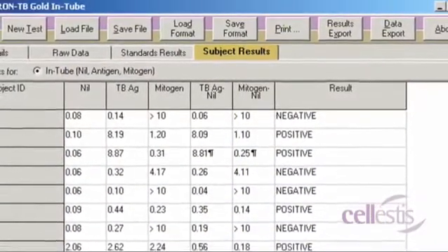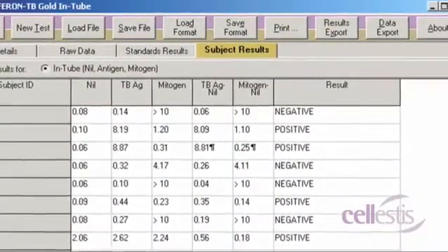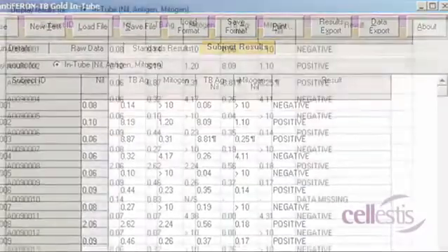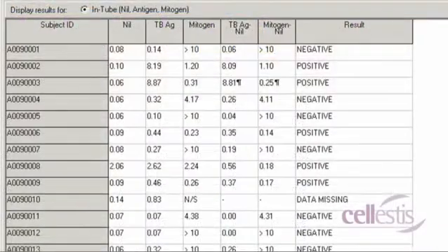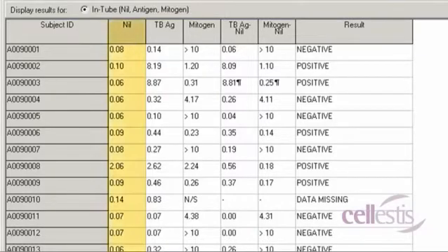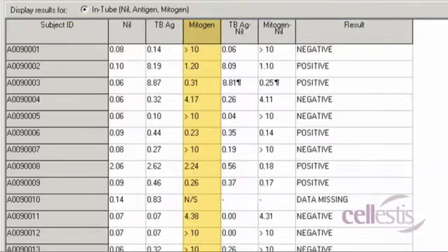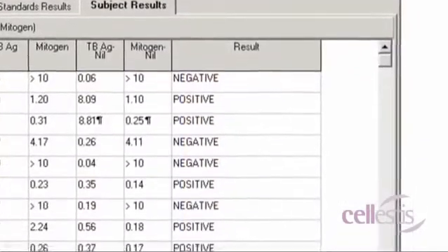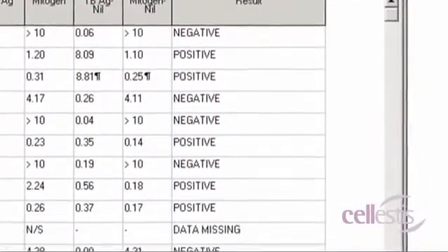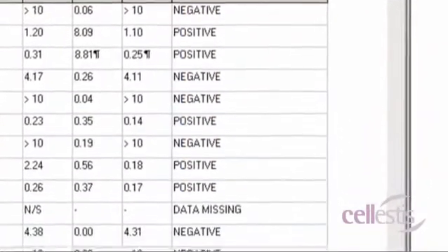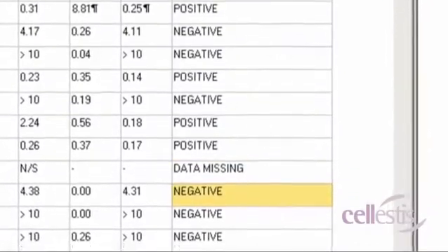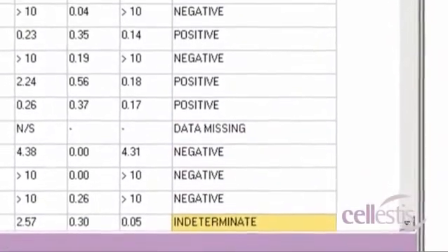Results for samples can be viewed under the Subject Results tab. The standard curve is used to calculate a value in international units per milliliter of interferon gamma for each subject's nil, TB antigen and mitogen samples. Based on these values, the result for each subject is then reported as positive, negative or indeterminate.